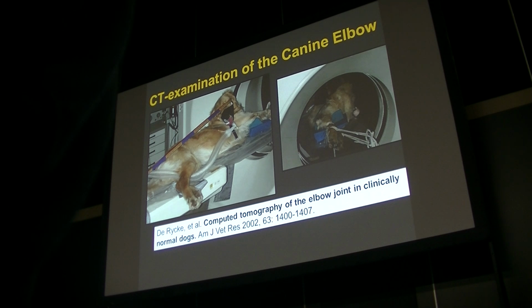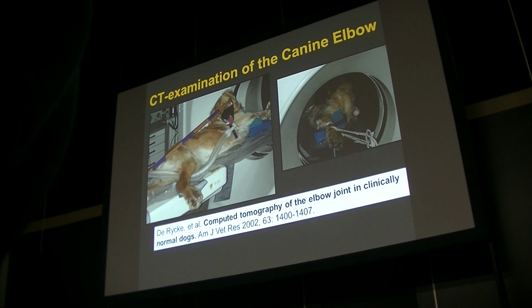So, that's about the different techniques. Something more about CT, and I'm in the procedure as well where we are standardizing the technique and positioning of how CT should be done for examination of an elbow joint, at least for official scoring.